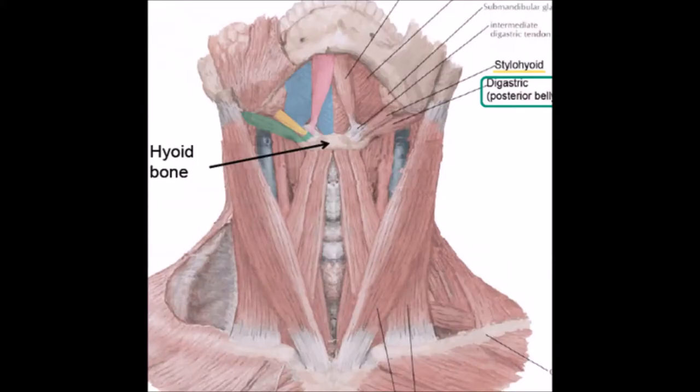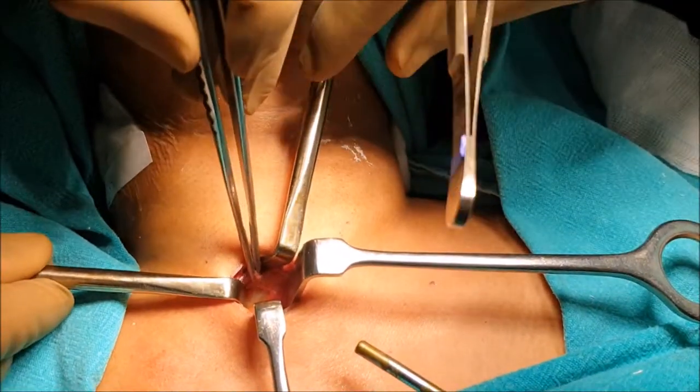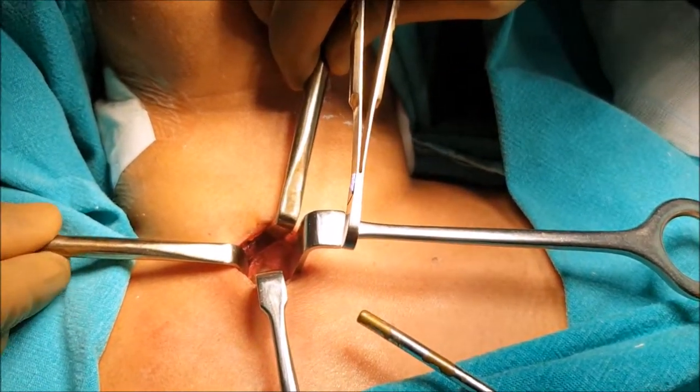Once we incise the deep fascia, strap muscles come into the picture. The midline is identified and the strap muscles are retracted laterally.